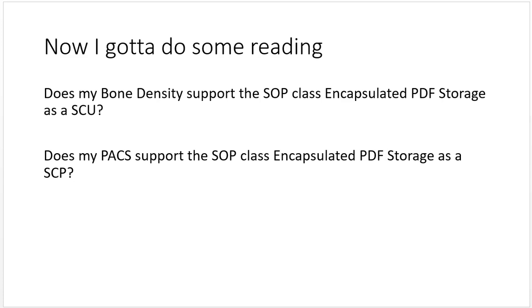So now I have to pull out the DCS for both the bone density unit and PACS, and it turns out that the bone density unit supports it as a SCU, but my PACS does not support encapsulated PDF storage as a SCP. So now, the only thing I can do is wait until there's an upgrade of the PACS system that then does support encapsulated PDF storage. And this is just one real-world example of when you would need to review the DICOM conformance statement.